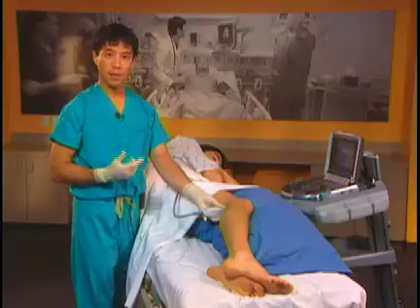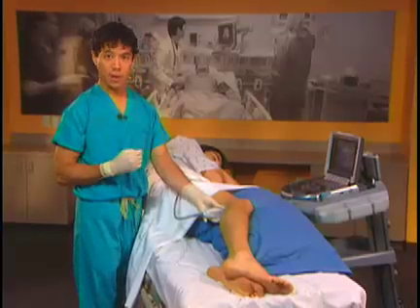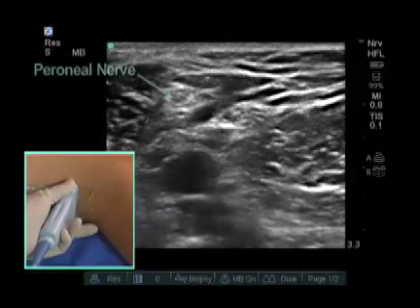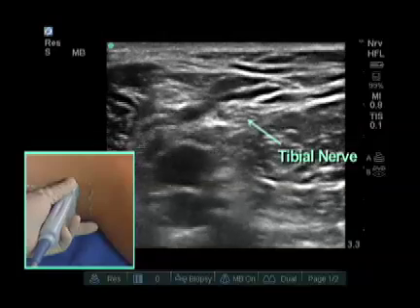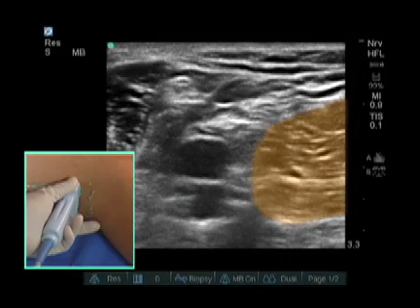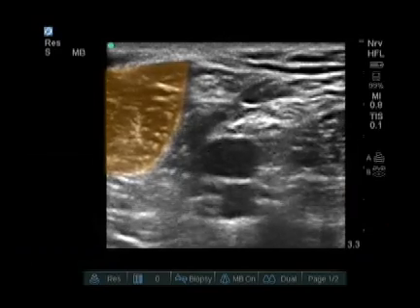As mentioned, at the popliteal fossa level this is only the tibial component of the sciatic nerve. We want to get the nerve where it comes together and has both components — the peroneal and the tibial. As we scan up the leg, we now see the peroneal component laterally, the tibial component medially, the popliteal vein, and popliteal artery. On the medial side we see the semitendinosus and semimembranosus muscles, and on the lateral side we see the biceps femoris, long and short heads.